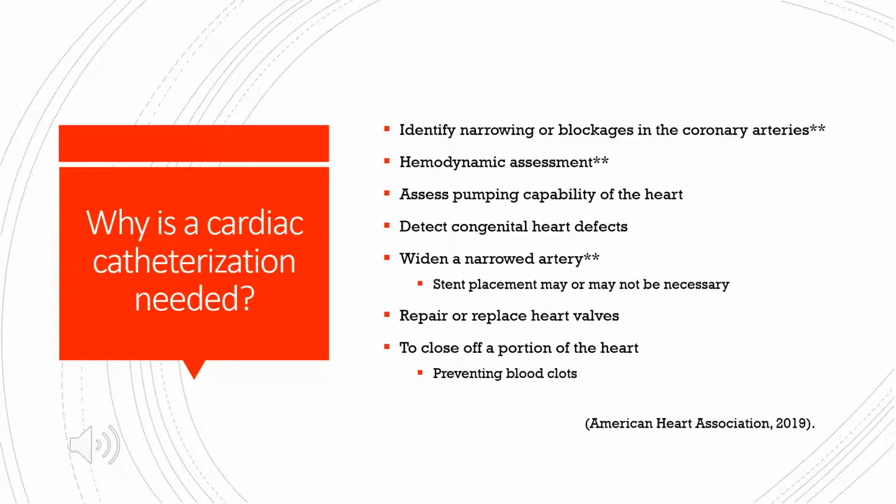In utilizing cardiac catheterization, the physician is able to take a closer look at the heart to identify the problems, as well as perform additional tests if needed for the patient's individualized care.